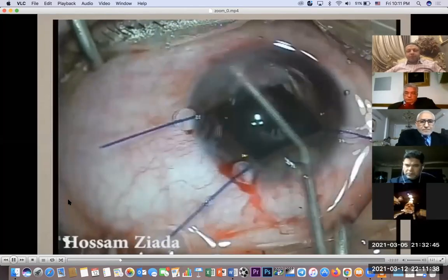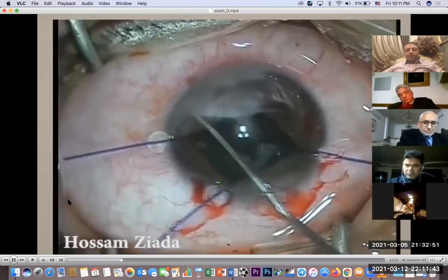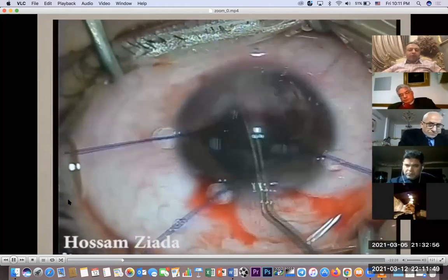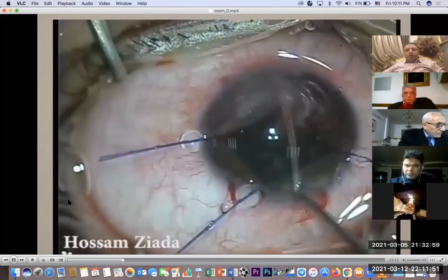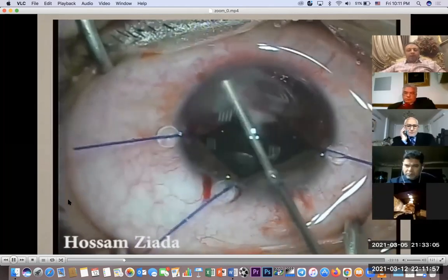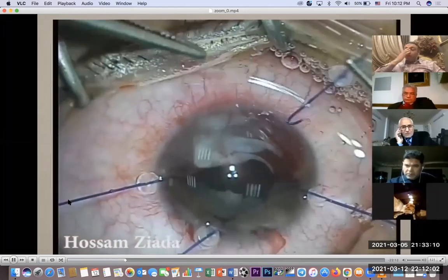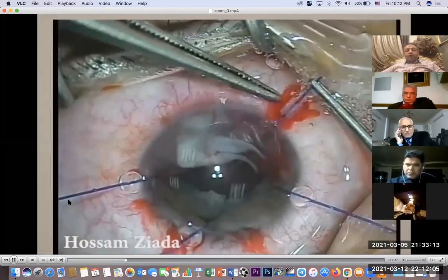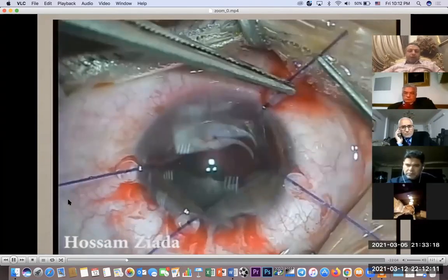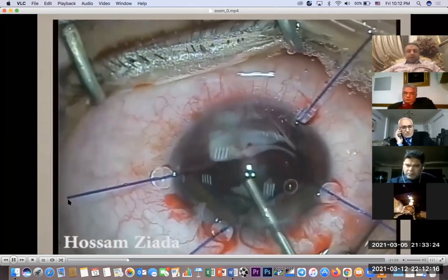But every other trial, I was injecting a lot of viscoelastic material to help get me a space, and at the same time it protects the cornea from this manipulation. Now I'm sure that there are no points of adhesion between the membrane and the back of the cornea. It's totally separated from the back of the cornea, but remains attached to the anterior surface of the iris.